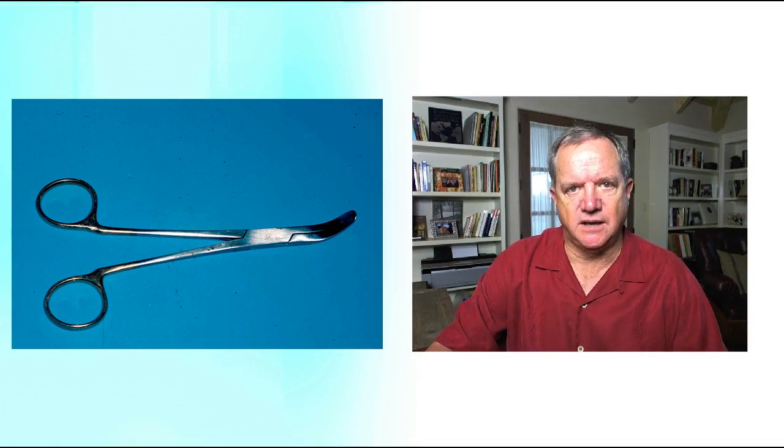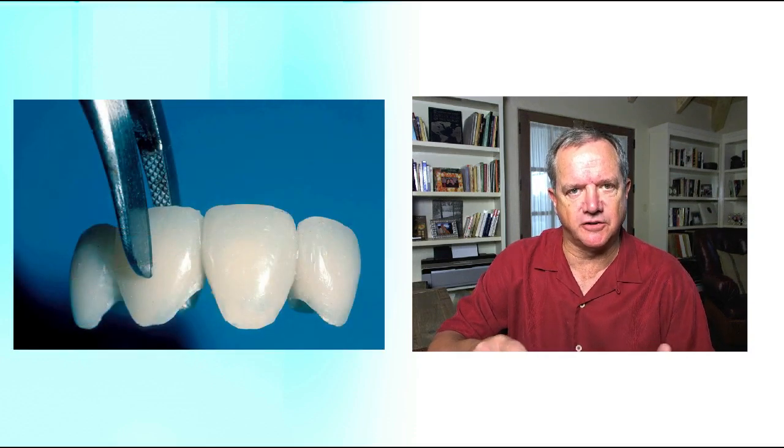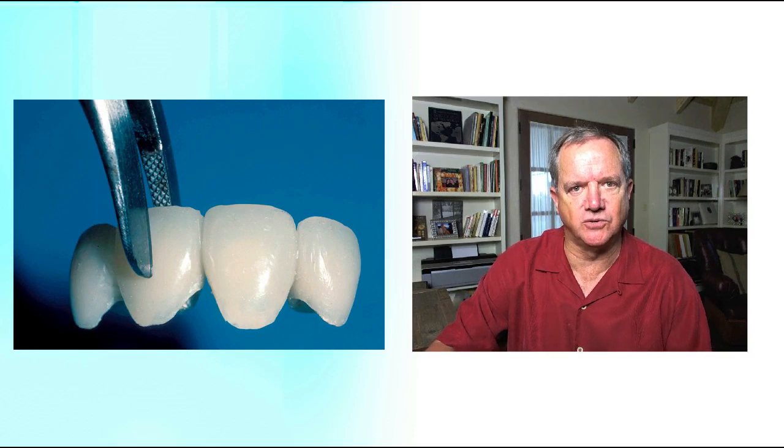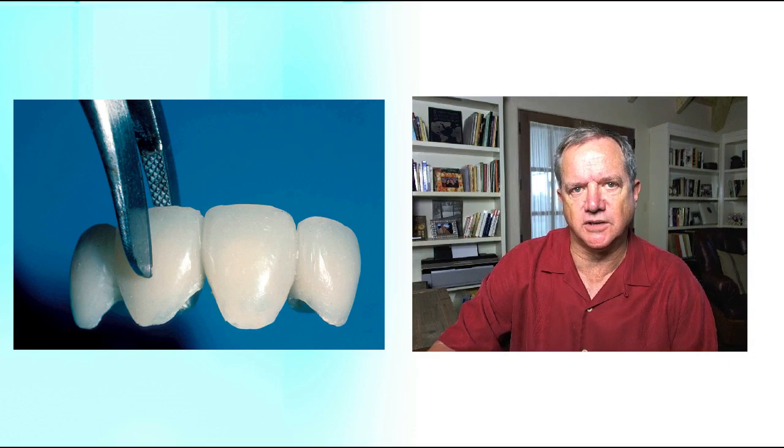And probably the tool I've used the most for literally almost 30 years is a pair of carbide tipped hemostats. And this happens to be a Miltex branded pair, but there's other ones on the market as well. The trouble with traditional hemostats is that they don't grip acrylic well and they slip and can pinch the patient. And there are certainly hemostats out there that are very fancy with screws that can tighten them and hold them, etc. But if you look closely at this picture, you'll see the nice carbide tip that's inserted into that hemostat, and it'll grab that temporary and really hold on to the acrylic well.